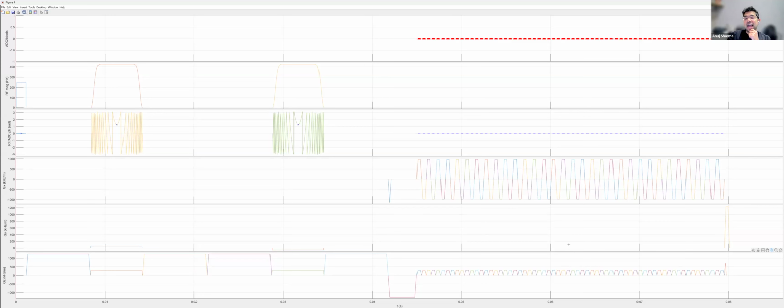I've also tried the add gradients function. There's a function called add gradients, which allows you to stitch gradients together to create a giant bipolar readout and then add that simultaneously with a flat GZ. But I can't quite remember what the issue was, but that didn't work. I think that didn't work during simulation, but I can't quite remember why. So just an open question. Is that possible? Is there another way that I'm missing?